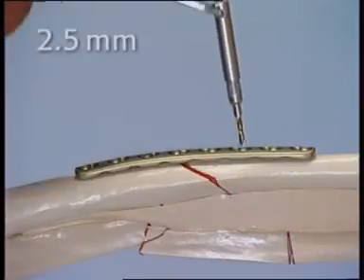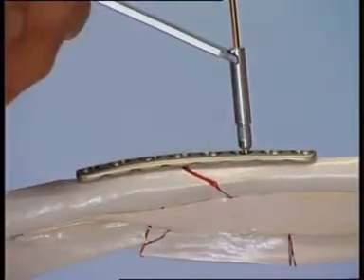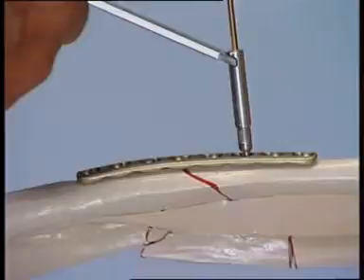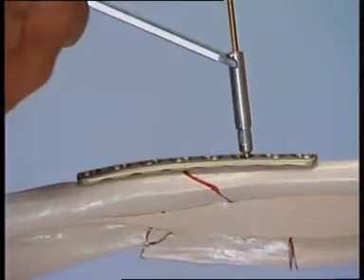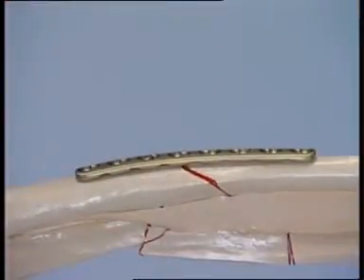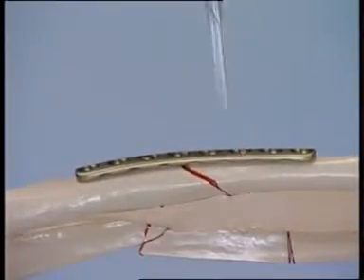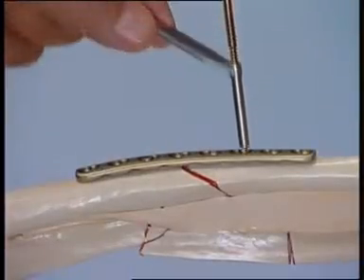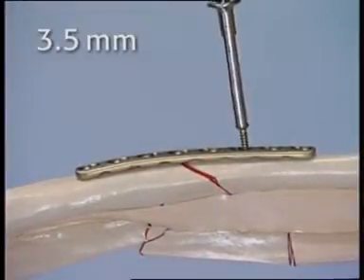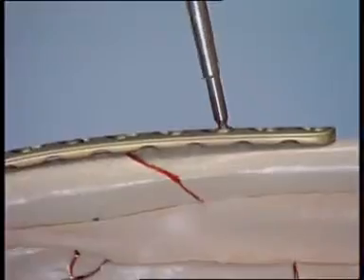In the distal fragment, a second hole is drilled close to the fracture using the universal drill guide in the compression mode to place the screw eccentrically into the plate hole. To do so, the telescopic sleeve of the guide may not be pressed onto the bone; instead, the sleeve is only held against the smooth end of the DC plate hole. The depth is measured and the thread is cut. The appropriate length 3.5 mm screw is inserted, and by driving the screw home, axial compression is created.